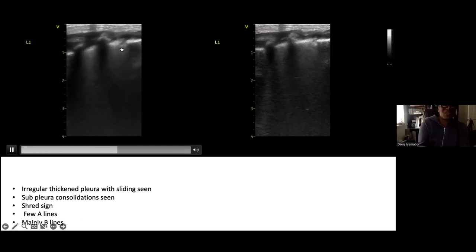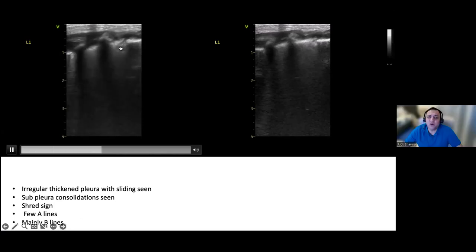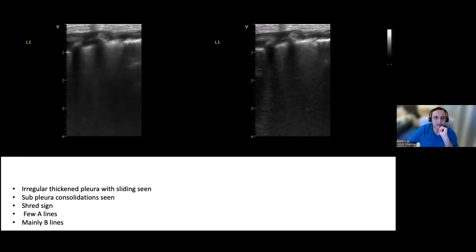I thought this was a shred sign, or is it just subpleural consolidation? No, it's more of a subpleural consolidation. That break, you've got a rib there, and sometimes when your probe is not horizontal, you get these intermittent breaks in the pleura, and you can see how you're slightly slanted. You have more soft tissue at the upper part of the image than at the lower part. So if you reorient your probe, you might be able to see the pleural line a little better. And you're using a frequency of 7, so your focus will be better at the deeper part of the lung, and sometimes that can affect how you interpret the pleura. But I wouldn't call that a shred sign at the moment, no.